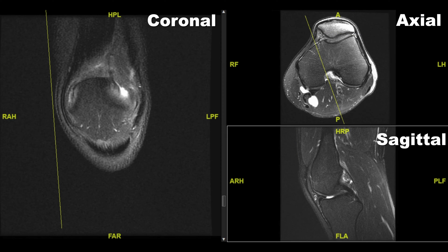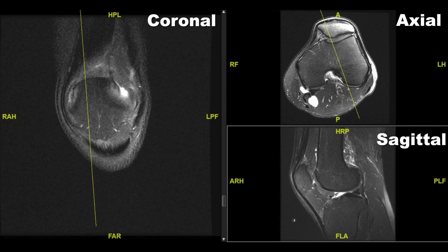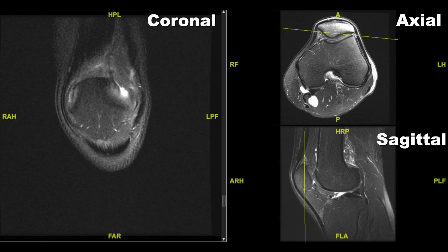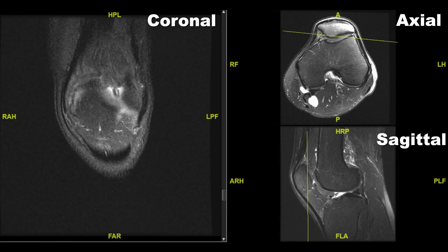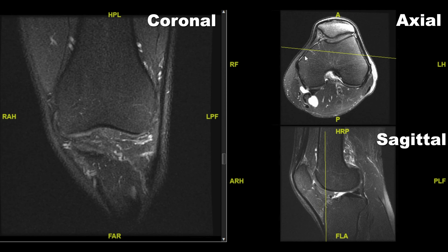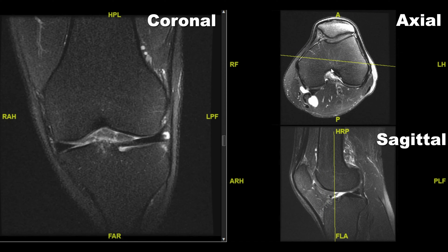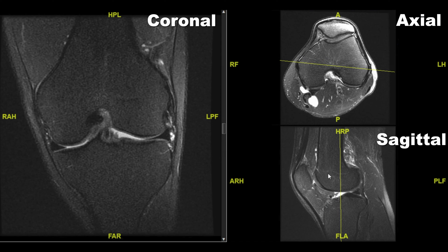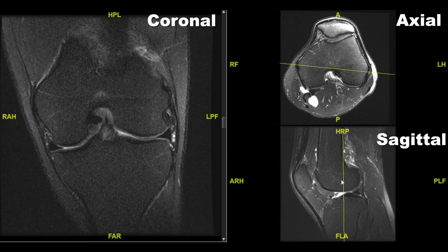Going down to the bottom right, we can see the front and back of the knee. On the coronal we can see our patella, and here's where we are in relation to the axial sequence and the sagittal sequence. As we start moving through to the posterior part of the knee, you can see how the localizer lines are moving towards the back of the knee on both the axial and sagittal.